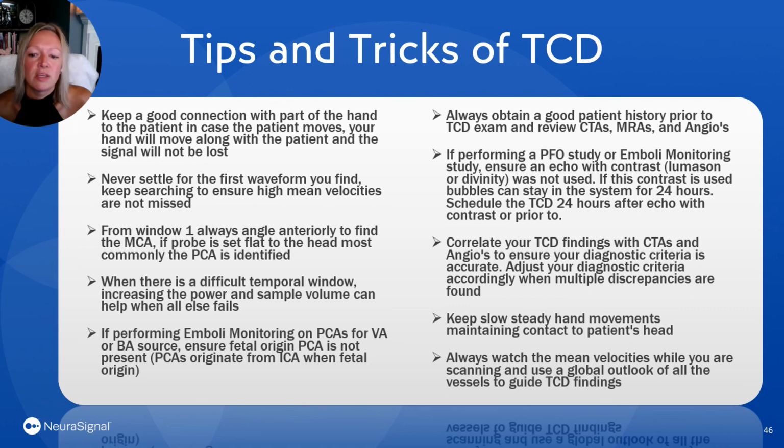Correlate your TCD findings with CTAs and angios. Ensure your diagnostic criteria is accurate. Adjust your diagnostic criteria accordingly. Keep your hand slow and steady for maintaining contact to the patient's head, and always watch for those high mean velocities when checking for stenosis or vasospasm.